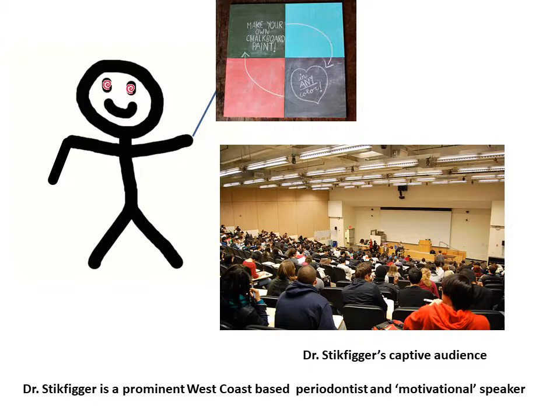We've evaluated interarch space and decided that we have sufficient space to place artificial teeth using an acrylic base. The patient has not had any previous partial dentures. We have several treatment approaches here, but treatment with a removable partial denture seems a logical choice, since it is very conservative and affordable. Implants may be considered at a later time, if the patient so chooses.